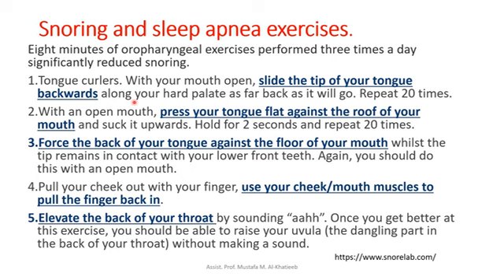Tongue curls: with your mouth open, slide the tip of your tongue backwards along the hard palate as far back as it will go. Repeat 20 times. With an open mouth, press your tongue flat against the roof of your mouth and suck it upwards. Hold for 2 seconds and repeat 20 times.